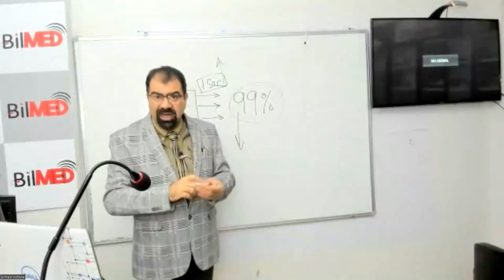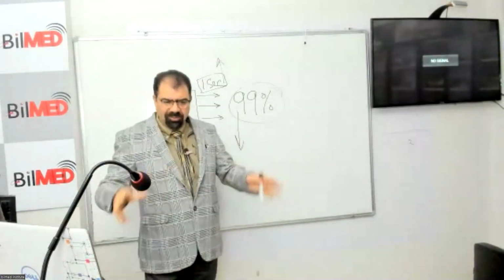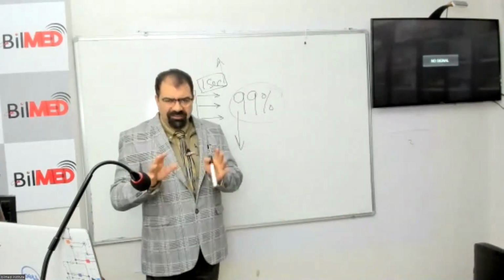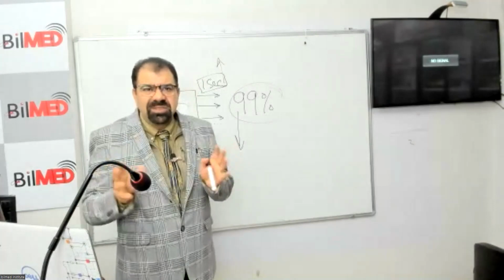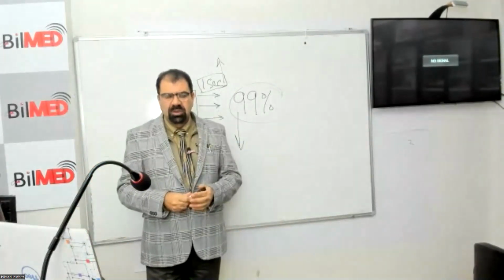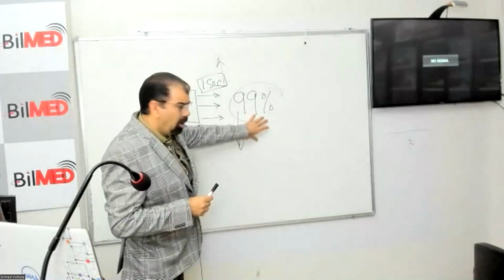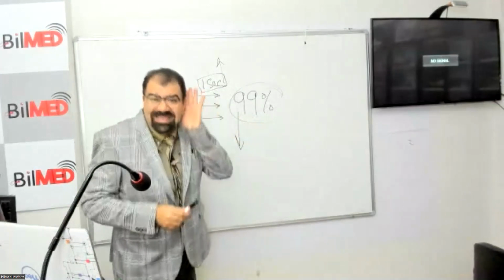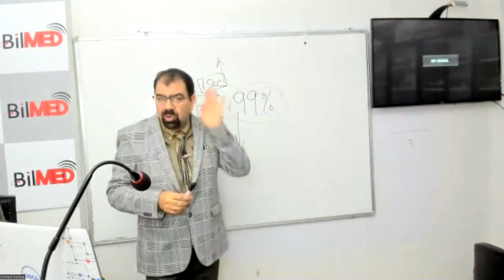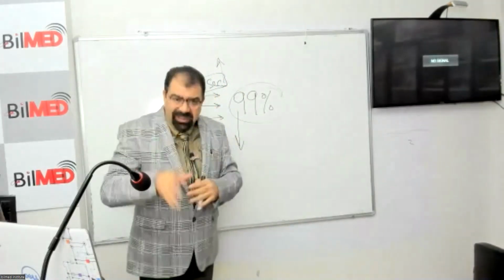Physics is damn important. And we doctors from this part of the world, in this Indian subcontinent, I'm very sorry to say, are weak with physics. That is why they are struggling with ultrasound. So this is physics here. So the point here is you have to give more time to machine to listen. And if you give less time to machine to listen, machine cannot work properly.